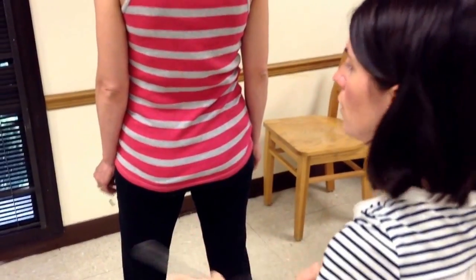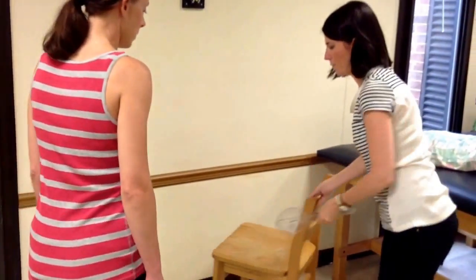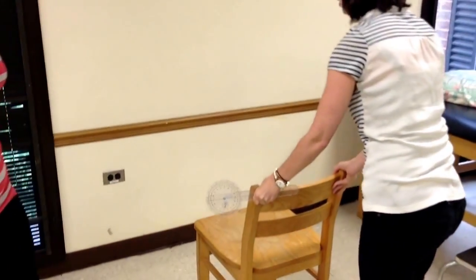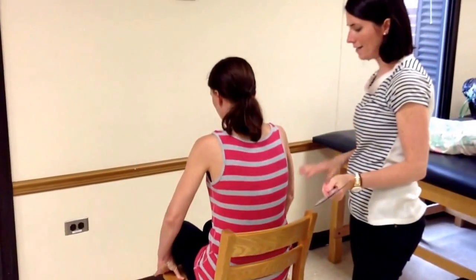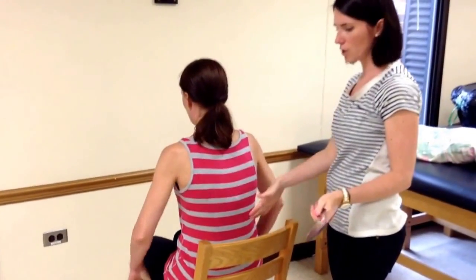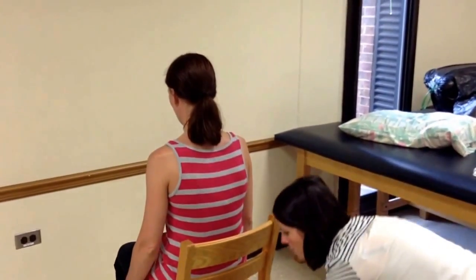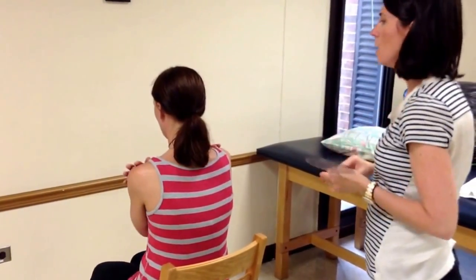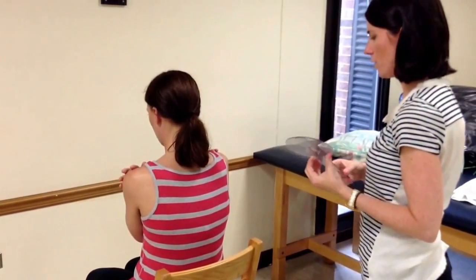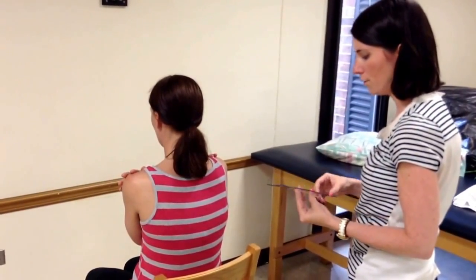Now we're going to move on and do trunk rotation range of motion. For this, we're going to have the patient sit in a chair with her feet on the floor, but her back is not supported by the chair — she moves up a couple of inches so the chair back does not impede her range of motion. We're going to have the patient cross her arms over her chest. Trunk rotation occurs in the transverse plane, and the normal value is 0 to 45 degrees.